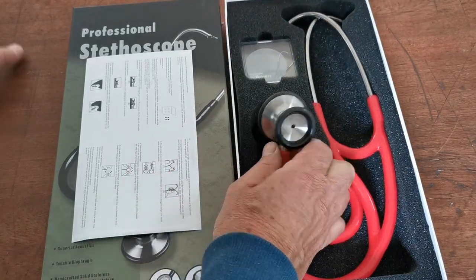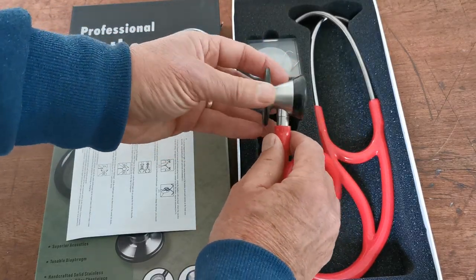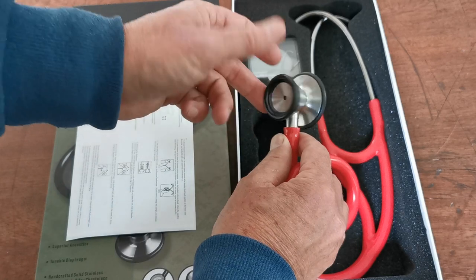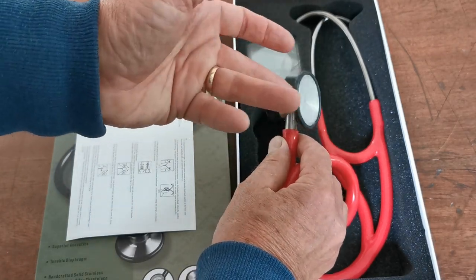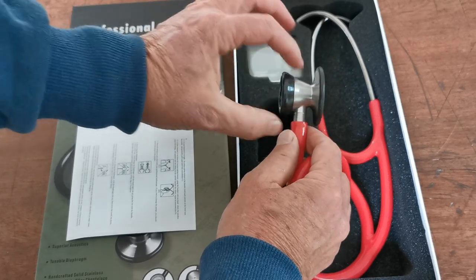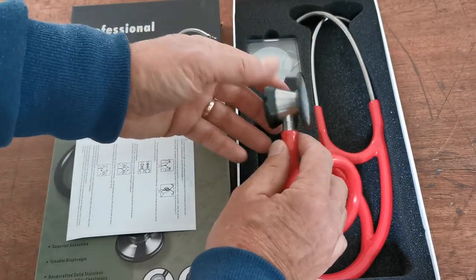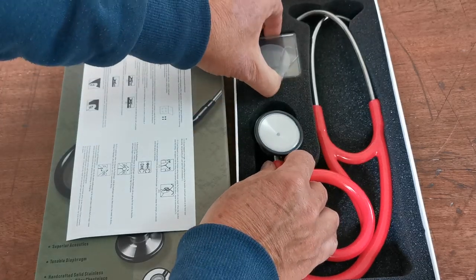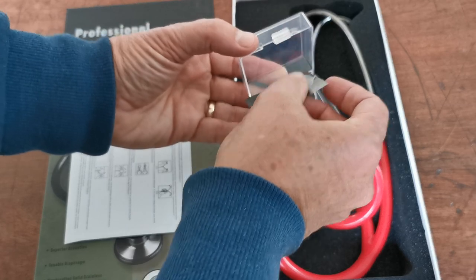Full-size adult chest piece. The quality of these, the weight in them — this is surgical steel. It rotates around a central core with a locking mechanism; I don't know whether you can hear that just locking into place. Lovely big full-size adult diaphragm and bell. We do supply in the spares, which comes packed in the box, a spare diaphragm.